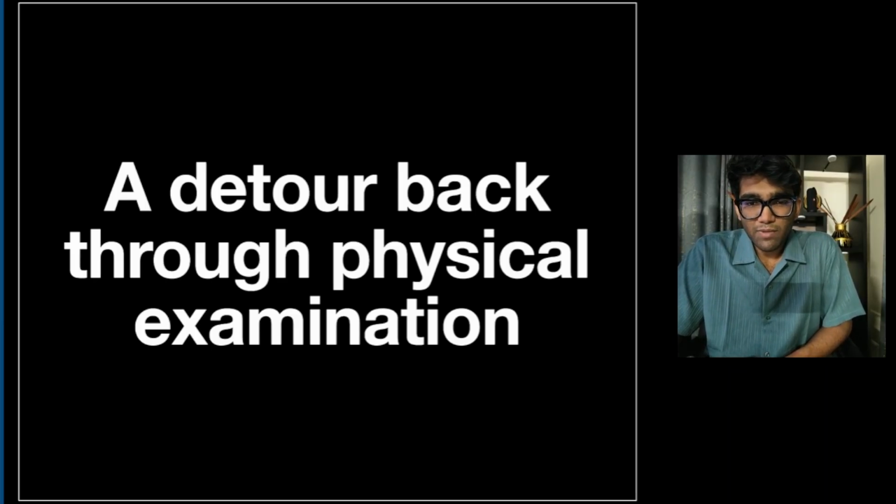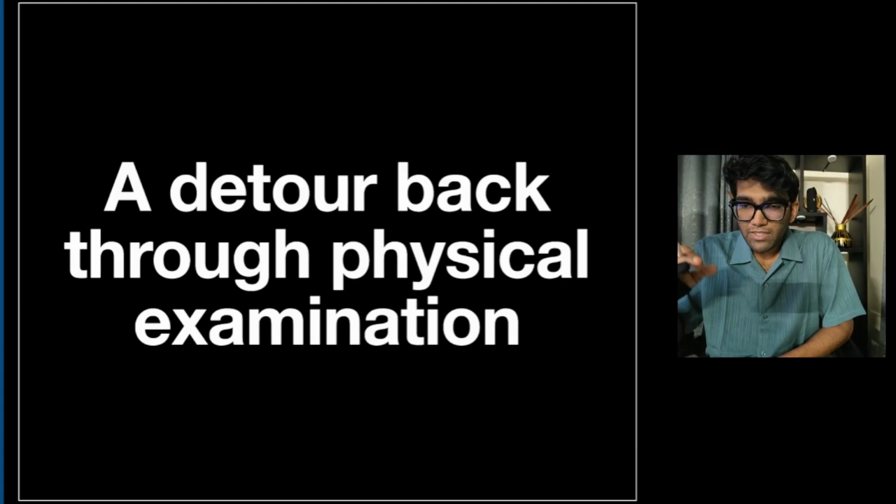and you might ask yourself why. The reason for this is that sometimes, as an internist or as a non-organ subspecialist, say I have a patient with systemic sclerosis, and the patient has chronic shortness of breath. I send the patient over to cardiology suspecting a diastolic dysfunction or a heart failure, and the report comes back saying there is diastolic dysfunction.